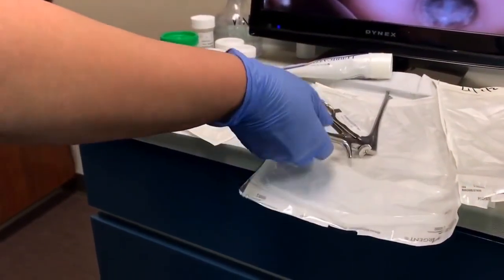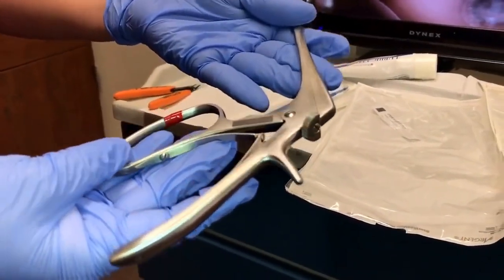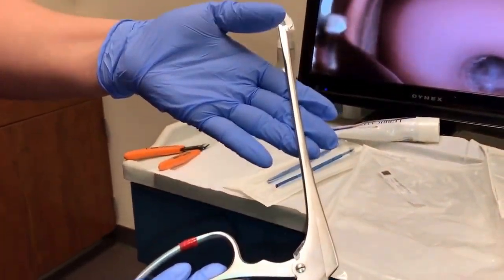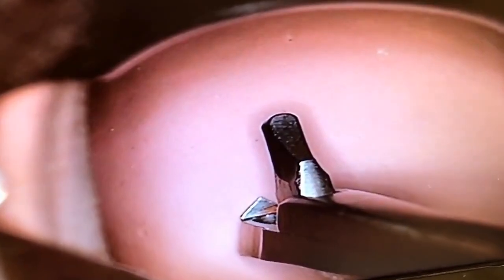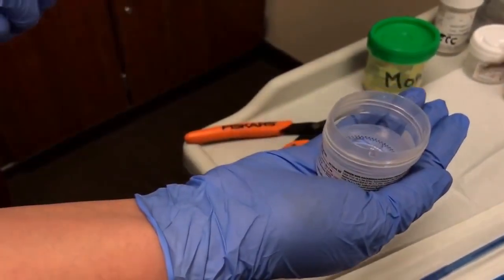Today we will be showing you both methods for collecting the biopsy. This instrument here is called the Tischler. It will be placed on the areas of concern and will then pinch off that part of the cervix. After the specimen has been collected, it will be placed into a vial.